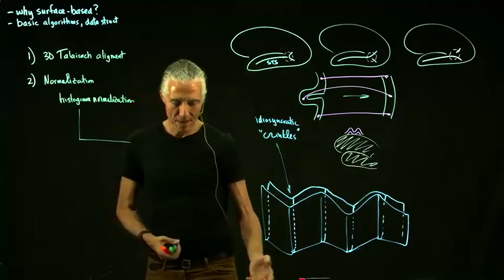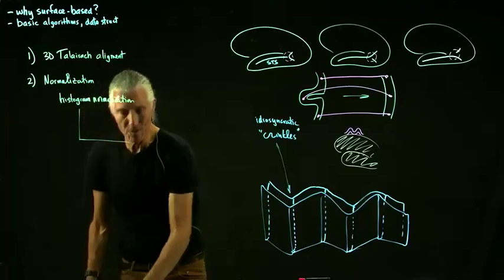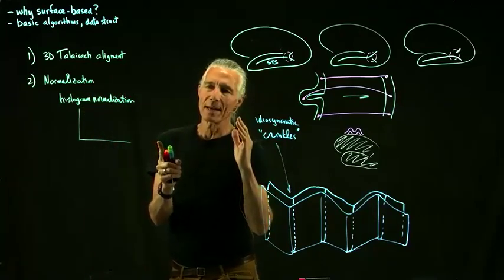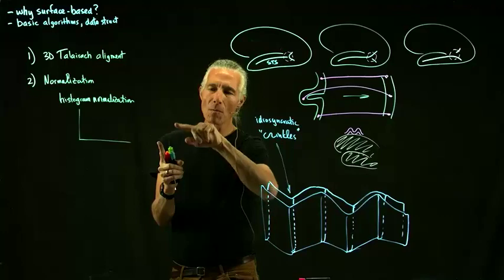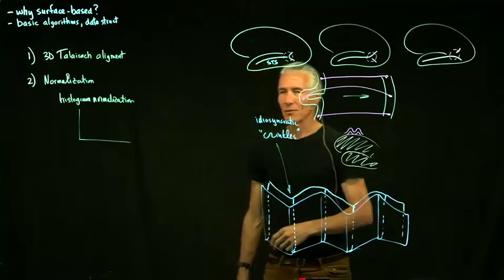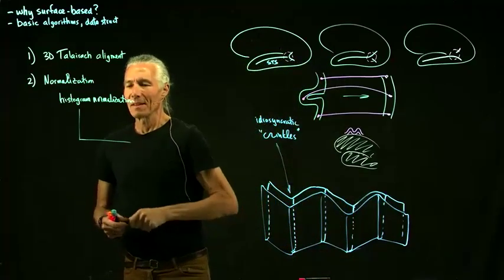This is something that your eye and your visual system can do extremely well. If you look at an image of a brain that's got a big brightness cast over it, like a 50%, 80% increase in brightness across the image, you'll have no problem recognizing where the cortex is. But to try to implement that in a computer program is a problem.